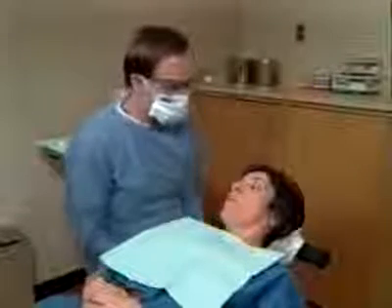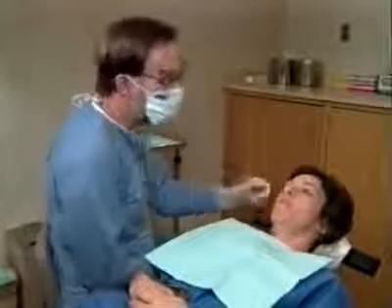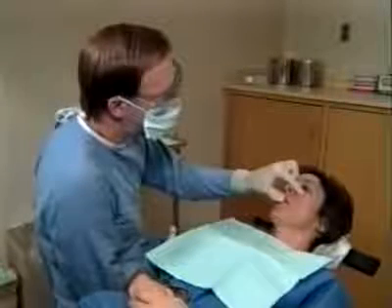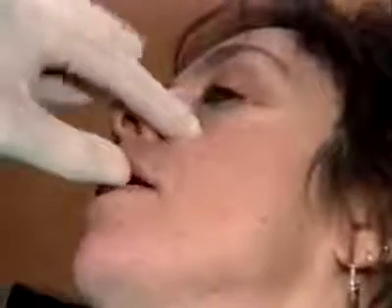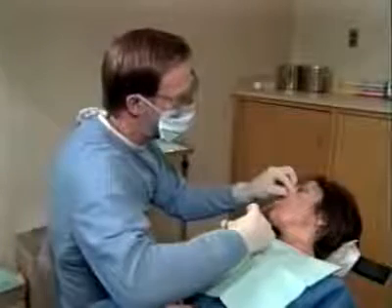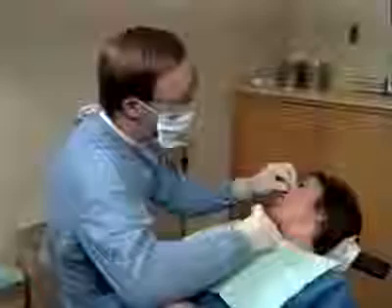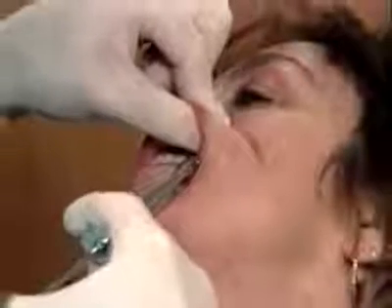For a right-handed operator performing a left infraorbital nerve block, the clinician should remain facing the patient, this time with the patient's head turned toward the operator's side. The left index finger is again used to palpate the infraorbital foramen and the thumb to reflect the upper lip. For the left-handed operator, the mirror image of the techniques illustrated in this video may be used.